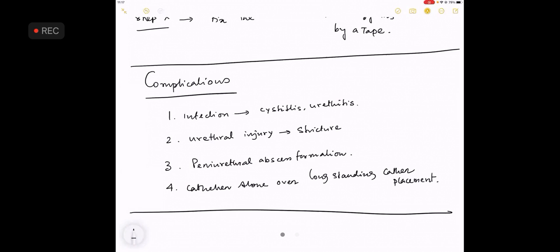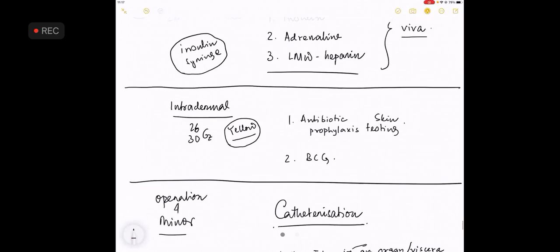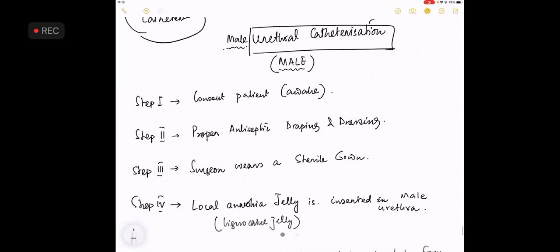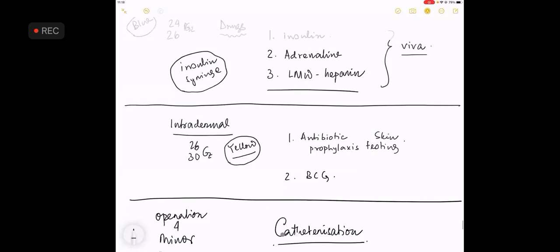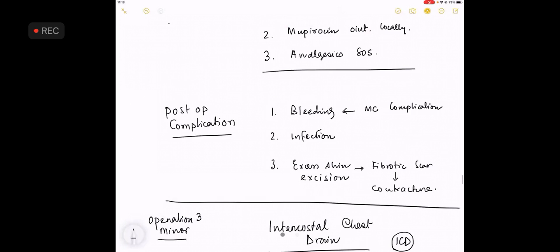Done, sir. So this is all about a very important part of the operation called a male urethral catheterization. Female urethral catheterization is taught by gynecology. Simple rubber catheterization is taught by medicine and gynecology, but Foley's catheterization is an extremely important question in exam, both medicine, surgery, pediatrics, and people will be asking you about these questions. So we have completed this big operative part also.